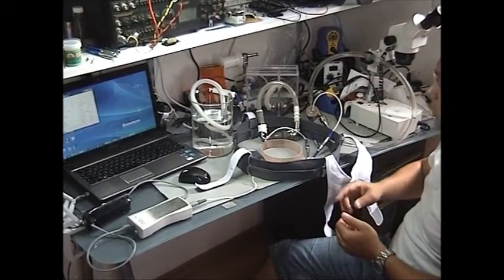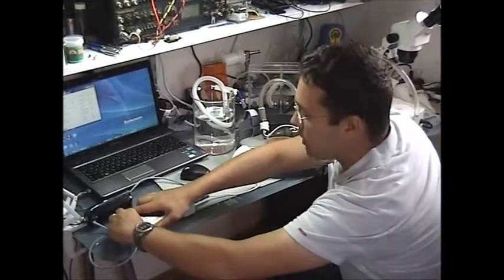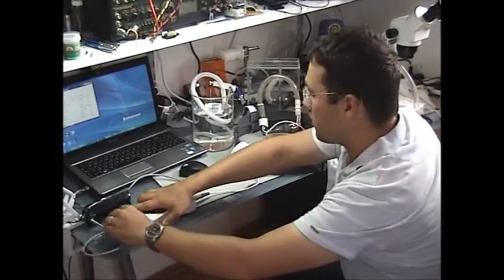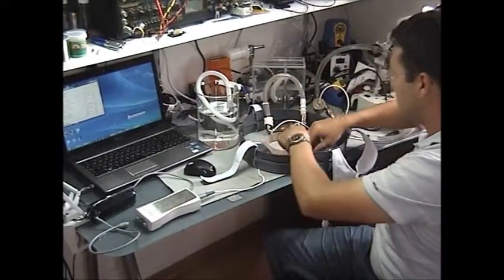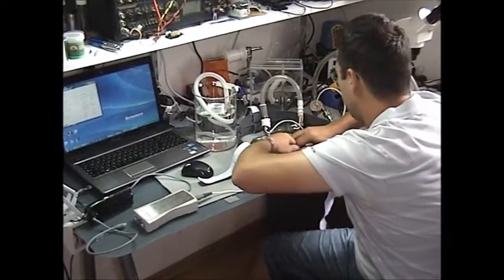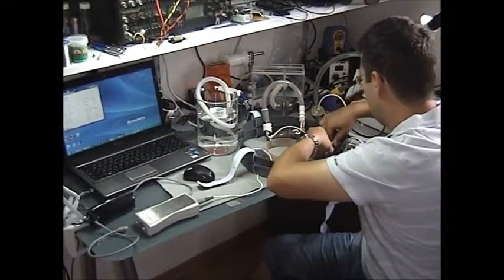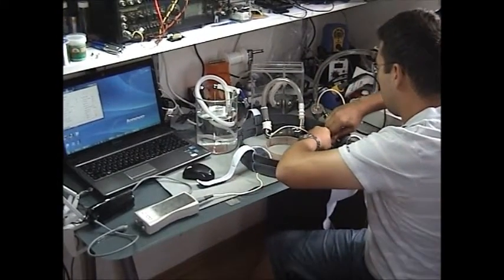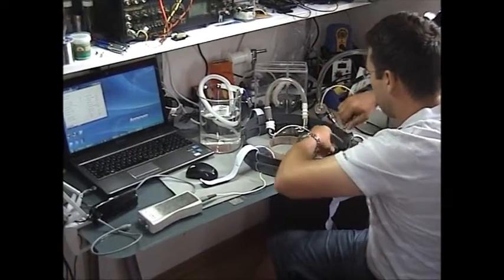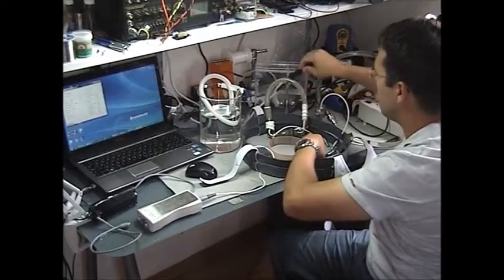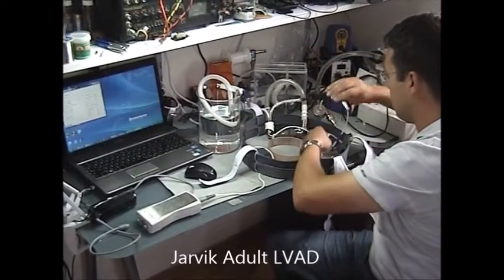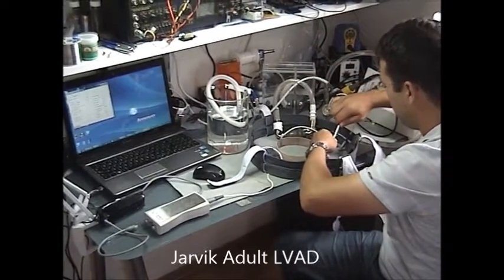I will change the pad. For that I will disconnect the external battery and the internal battery. We will connect another VAD. This is Jarvik Adult VAD.